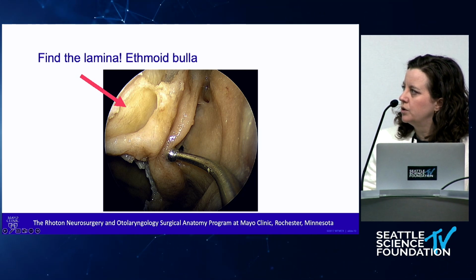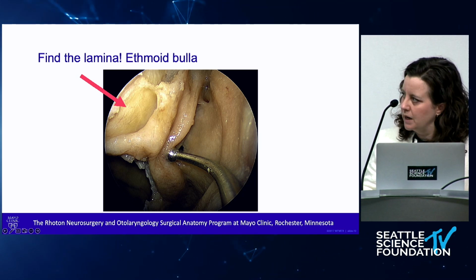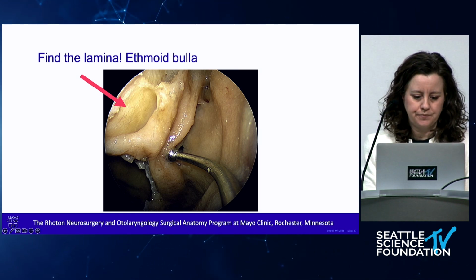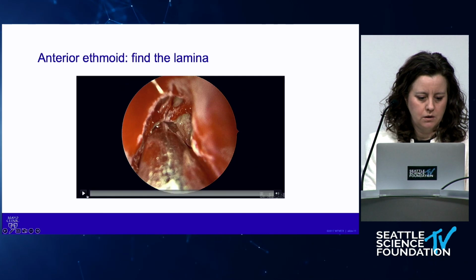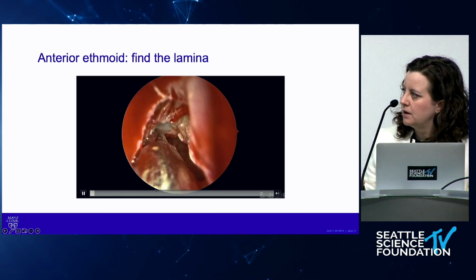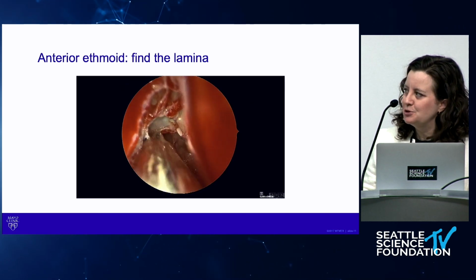This probe is towards the retrobullar space. You can use a curette here. Frankly, I just microdebride that off also. We're starting to see the basal lamella here. So again, I'm sort of a one-trick pony here. I like to use the microdebrider.